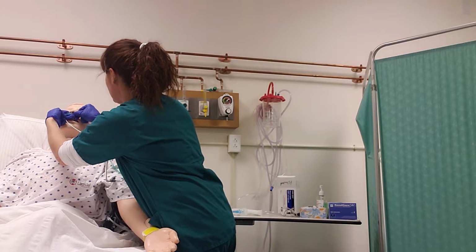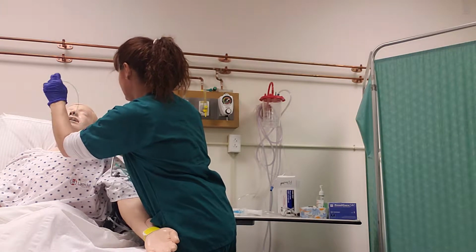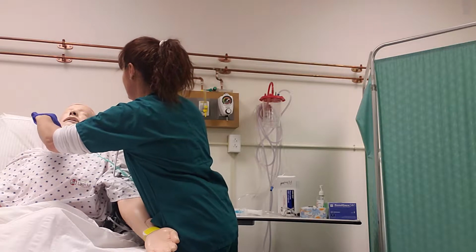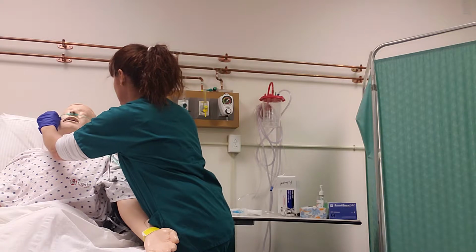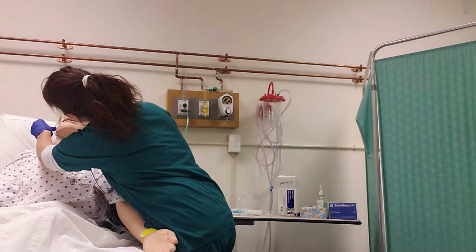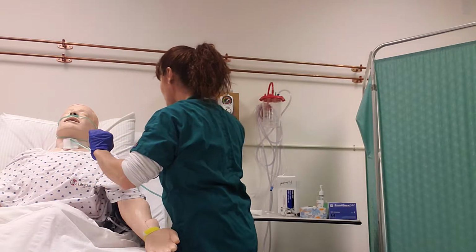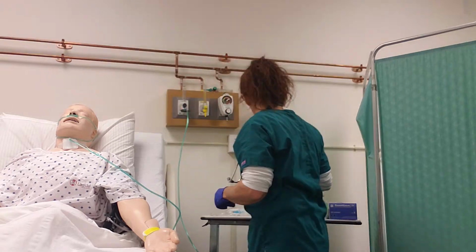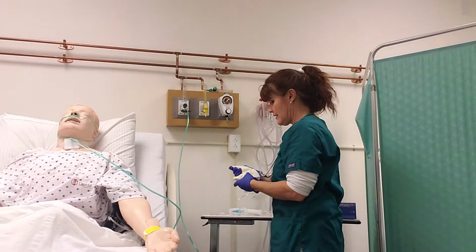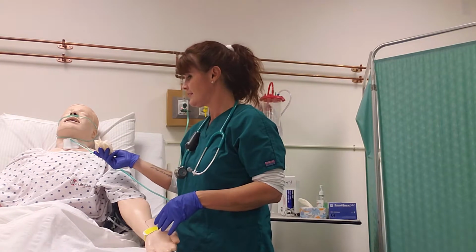Alrighty. Here, let me get this, whoops. Sorry about that. I think this is my first rodeo. Alright, so now we should have you breathing together. I need you to give me a good cough. Here's your napkin. If you've got any yuckies in there, you just go ahead and cough it in this.